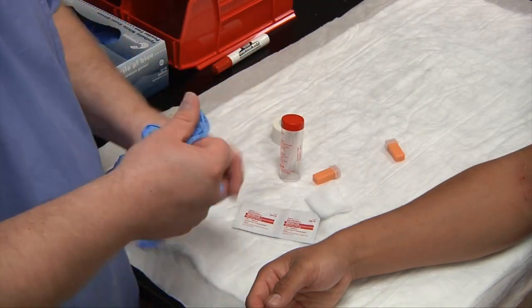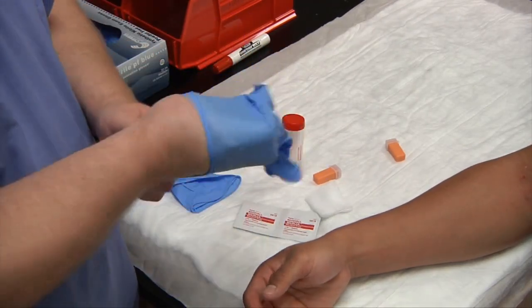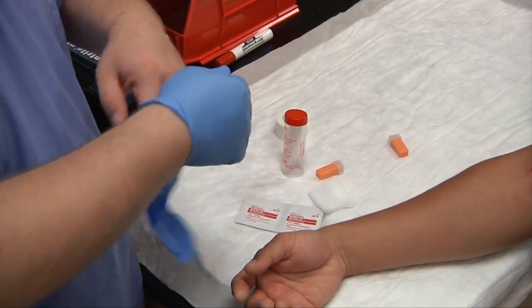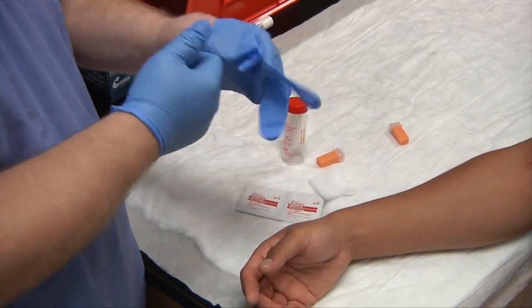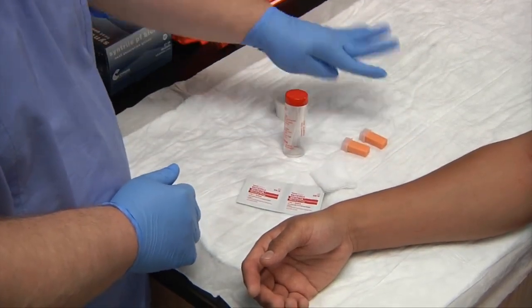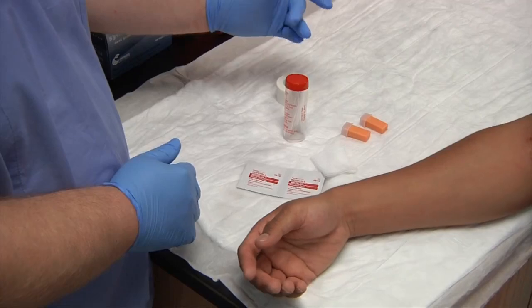Let's go ahead and put our gloves on. I've already obtained consent from my patient and informed them of the procedure. As you see, I have two lancets out — you want to make sure that you always have backup equipment in case the lancet does not work.